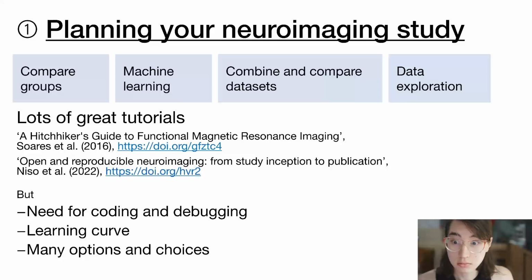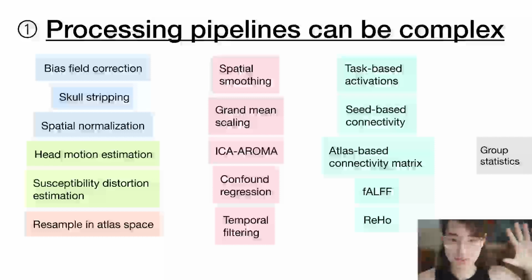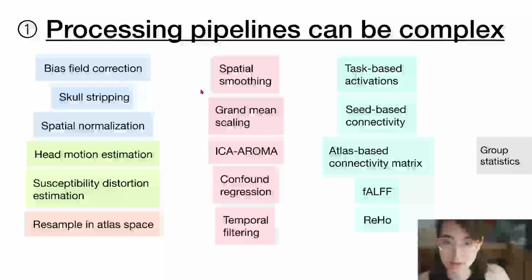And the other thing that you will notice is that for each and everything you want to do to your data, to get it closer to something that can answer your research questions, there's so many different options and choices for each one of those steps. So I've just put on the slide, it's maybe a bit dense, all the different things you can do. Well, there's even more, of course, but some of the things that make sense to do, I've just put on the slide. There's still more.